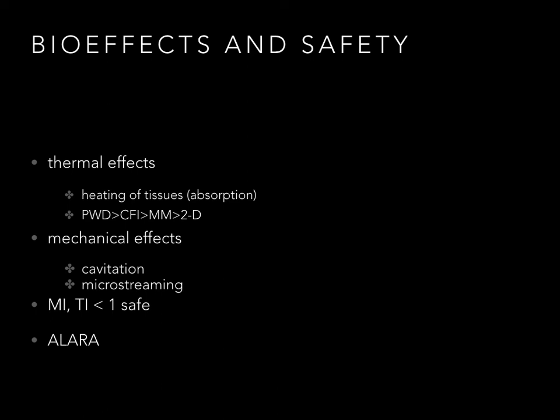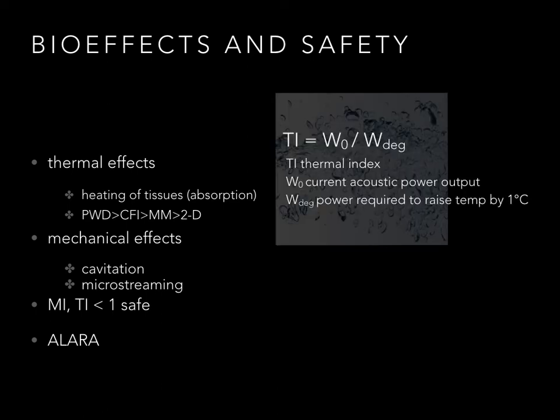Thermal effect is the heating of tissues by attenuation or absorption of the ultrasound beam. This converts ultrasound energy into heat. Thermal effect depends on output power, transducer frequency, and exposure time. The thermal index, TI, is displayed on the ultrasound screen.